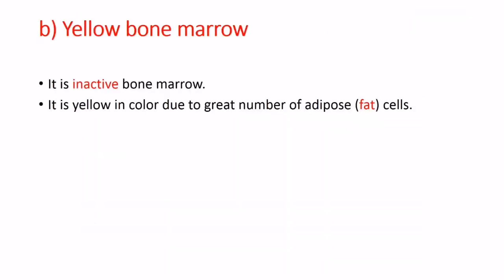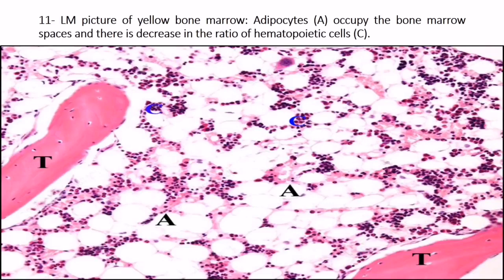Yellow bone marrow is inactive bone marrow. It is yellow in color due to the great number of adipose fat cells. A light microscopic picture of yellow bone marrow shows adipocytes occupying the bone marrow space, with a decrease in the ratio of hematopoietic cells.